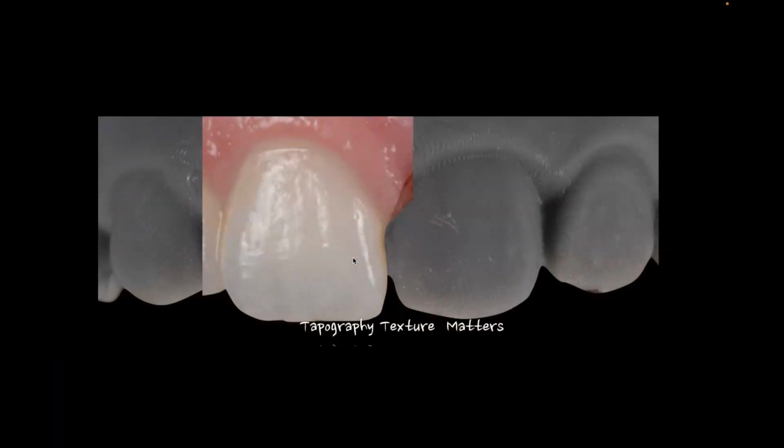When it's a little more complicated, like this particular case, I've mentioned in previous webinars that I don't want to do these smaller cases on digital models. You'll also notice that other larger case wasn't a digital model either. So not only am I slightly anti with the full arch zirconia restorations, I'm slightly anti some of these cases on strictly digital models. Digital is fabulous. Everybody knows I have 3 printers here and we're printing all day long. And we do work a lot on printed models for a lot of the cases.